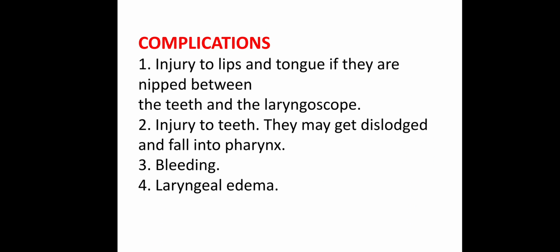Complications: injury to lips and tongue if they are nipped between the teeth and laryngoscope, injury to teeth, which may dislodge and fall into the pharynx, bleeding, laryngeal edema.